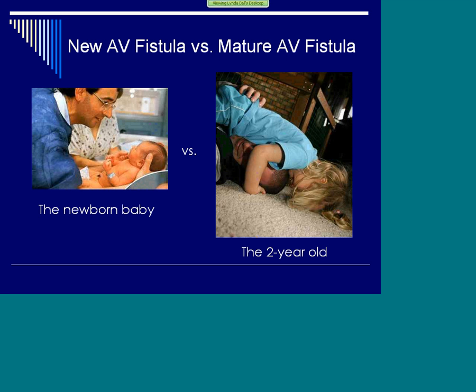And the same is true with any fistula. You can't guess and say, I'll give it a try and see what happens. That's not the way we want you to, we don't want your mind in that state. We want you to be confident. We want you to assess it. And if you believe that this access is not ready to cannulate, then we want to know that you know enough to say, it's not ready, I can't do it.